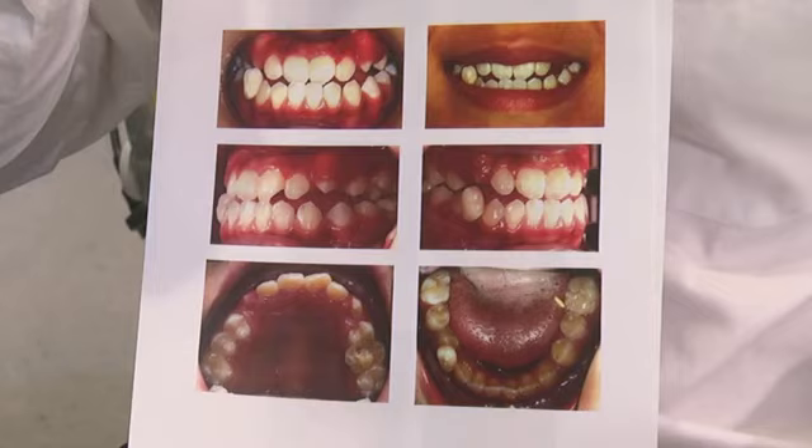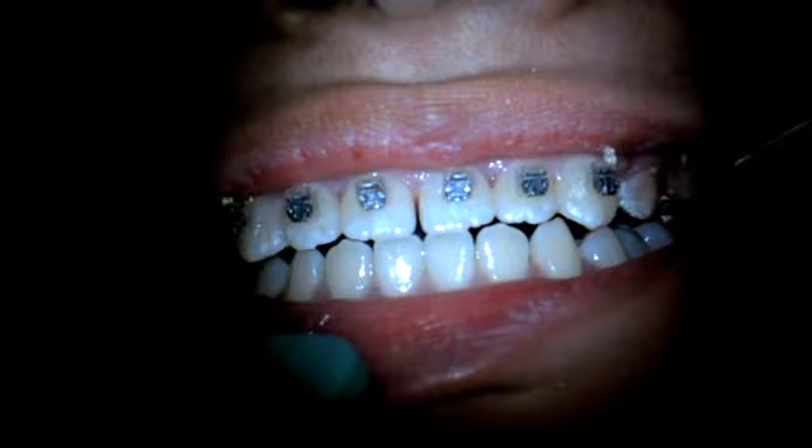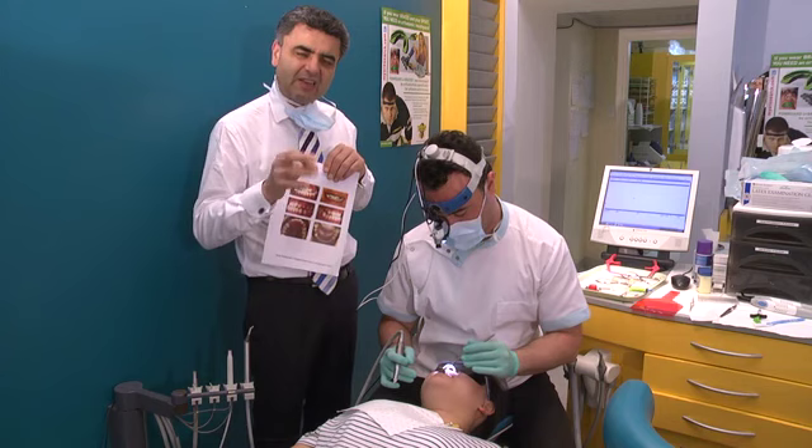You can see what improvement this has had on the vertical. Once we take the hyrax out, the bite actually closes, and as it closes it closes over the cross bite, which gives us very good stability. You can see the front teeth have now come over, and with light coil we'll continue to drive them forward. If need be, and we have late growth of the mandible, this could always become a John Lynn technique where we have TADs in the lower jaw with Class III pull to continue to correct the Class III jaw pattern.